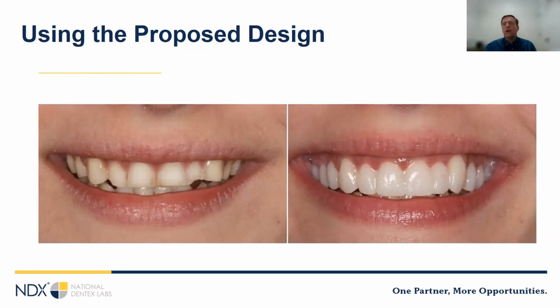So we got our template figured out, and we got to kind of figure out what our next steps are. For opening the bite, we're definitely going to want to do a PMMA occlusal overlay bonded to our posterior teeth to let the patient feel the bite. A little trick with that is it's nicer to have those made in single segments. So like a 4-unit segment, then you bond it, then segment between it. Because bonding those individual pieces is kind of a pain.